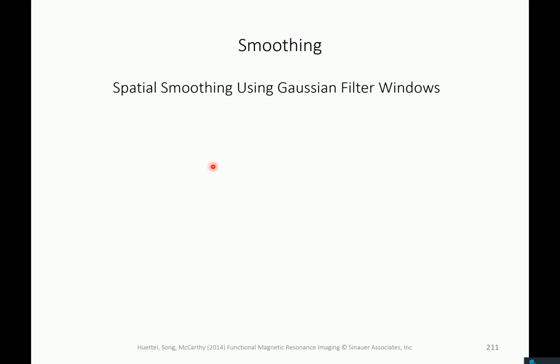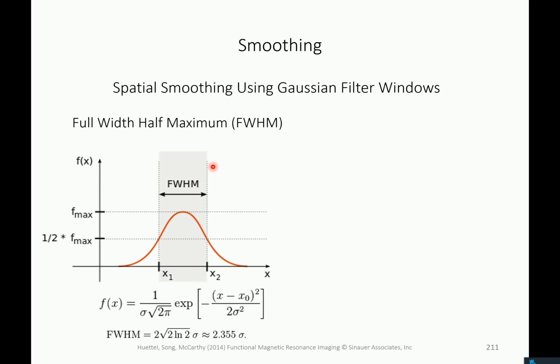Often what is also used in preprocessing, I think I usually do that after normalization, but it's here now before normalization, is spatial smoothing, which is just computing essentially weighted averages with what is in this context called a kernel function, which is just a Gaussian. It is usually quantified in terms of its full width at half maximum, which is just a conversion of its standard deviation.